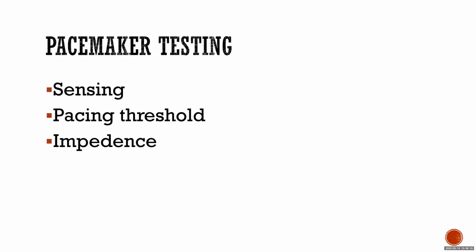Oh, there you go. So, pacemaker testing. When we test pacemakers, there are three things that we need to test. We need to test sensing, we need to test pacing, we need to test impedance. And we'll see why these are the three main functions of the pacemaker.